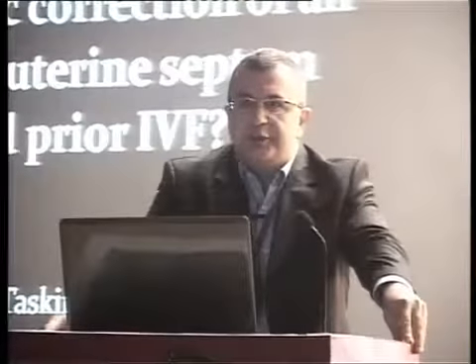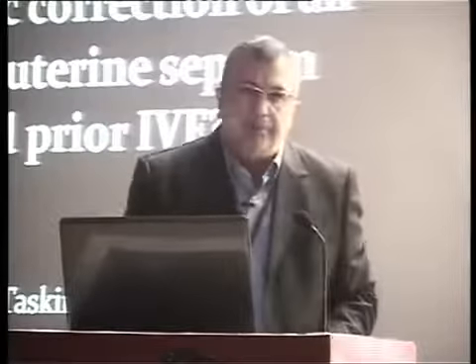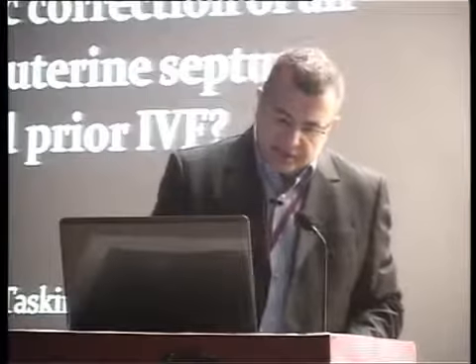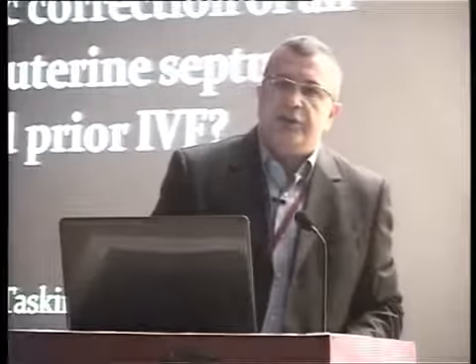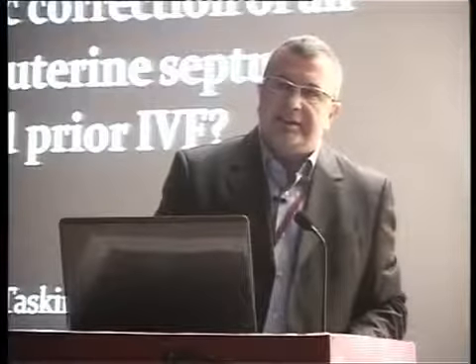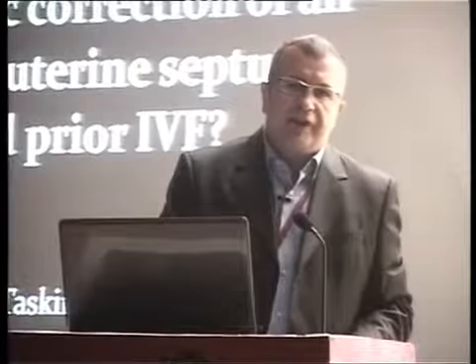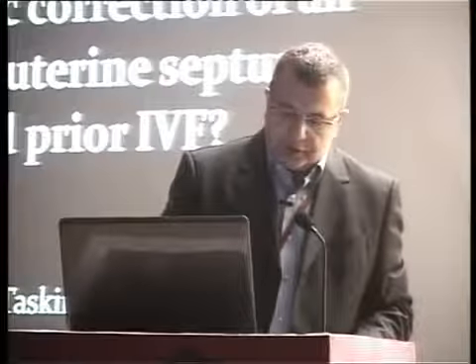Everybody's hungry. I will shortly summarize this topic for you and then take questions. My topic is hysteroscopic correction of an incomplete uterine septum justified prior to IVF. As we published in 1995 from Baylor College of Medicine, we have been using office hysteroscopy since then, and we have published that screening office hysteroscopy should be done prior to each IVF cycle to rule out any uterine anomaly.